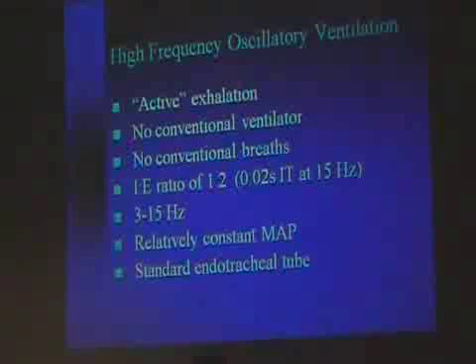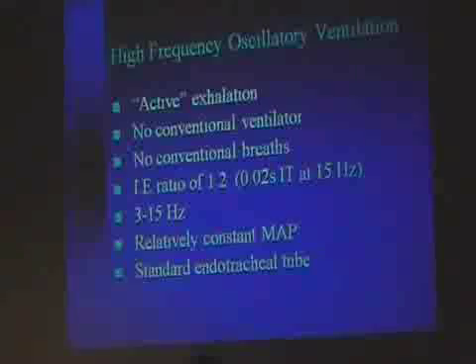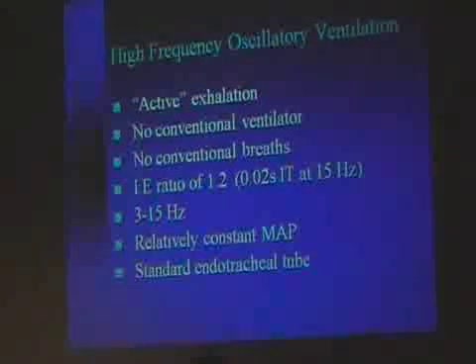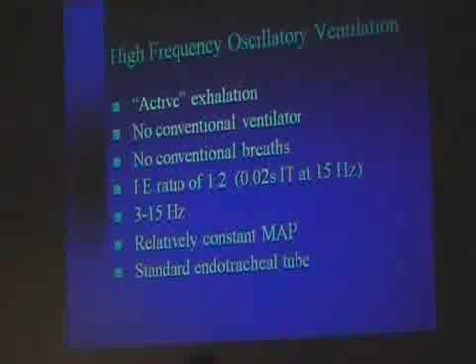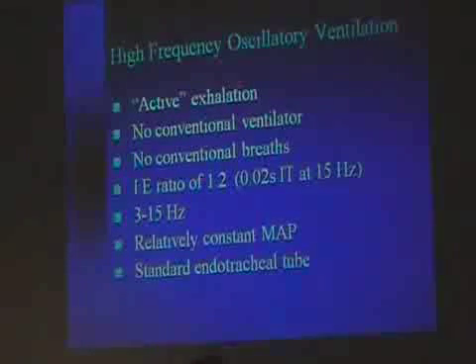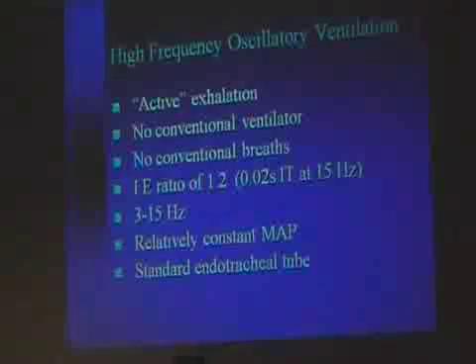But at the present time in this country, and this is not true in Europe, where there are other kinds of combination ventilators. So that has a volume guarantee or just pressure? It has a volume guarantee for the conventional mode. It also has a volume monitoring for the high frequency mode, which I'm not sure how useful that is, but you can actually monitor your tidal volume during the high frequency mode. So it may be useful. We're just going to have to see. Not yet approved by FDA, still under very initial investigations. So stay tuned. We're hoping Stony Brook can be part of that trial, which would be exciting.